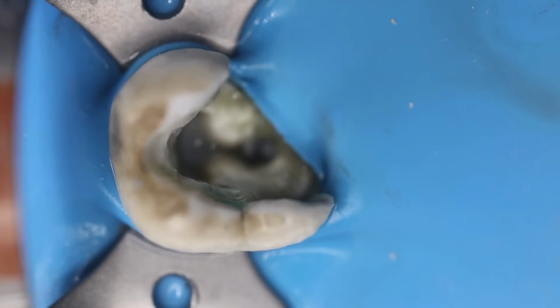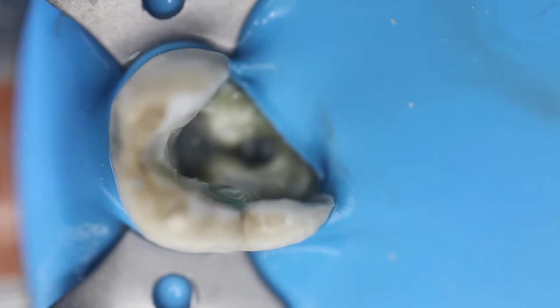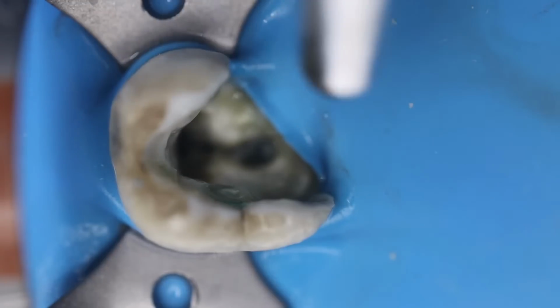This is the size 1 that we used in the canals. So once we have used this, our orifices are enlarged.